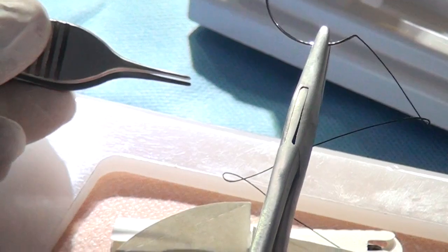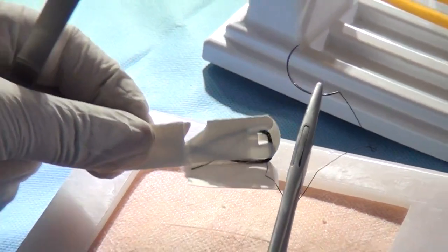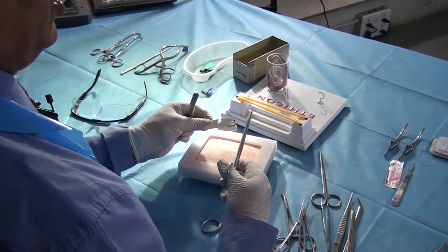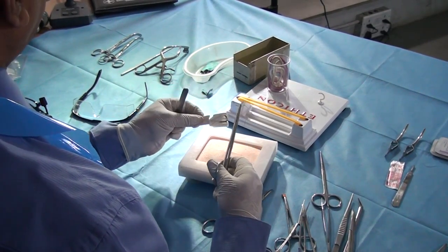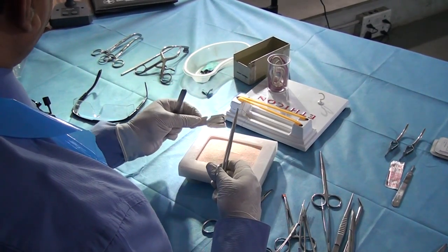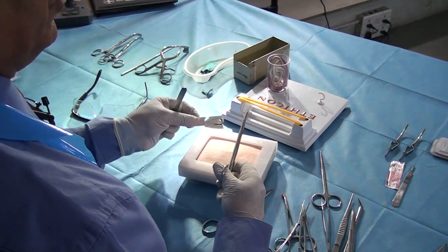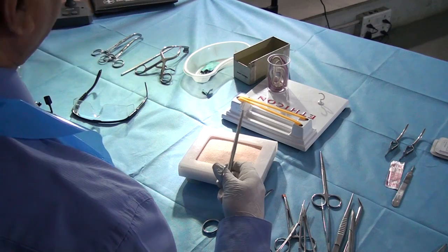Clear? Once I've locked it, how do I get it? Get the suture out of the wrapper. Please watch carefully. Do not pull the needle off. Certainly do not pull both the wrapper and the needle off. What you should do is take the wrapper away.